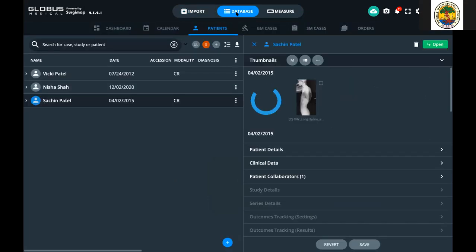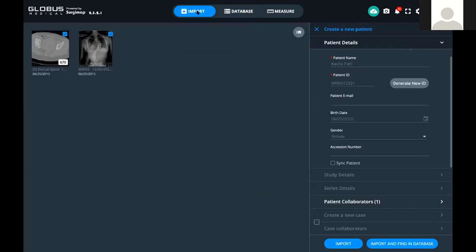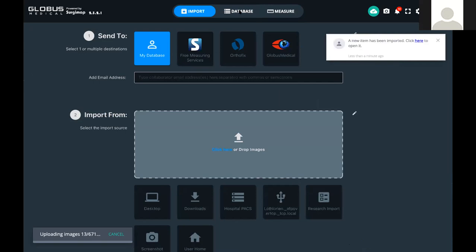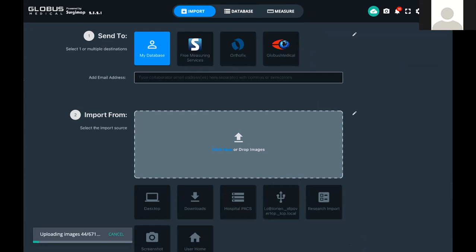What does it say when you import the complete folder? So when I downloaded the thing which you had sent onto the desktop, when I go to each folder, the subfolder opens up. I see Jyoti Singh. I can see the PNG image which you have loaded, right? So I have to individually load them because I get the save icon on the right side, with cancel and save. So when I save, it goes into the import page, right? When I go to the next patient, it only takes one image, not the entire folder. That is okay. As long as you drag the whole folder into that area, the whole thing will get imported, whether you are seeing different images or just one image.